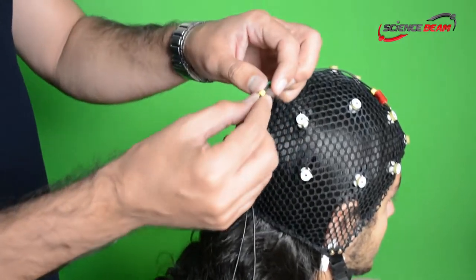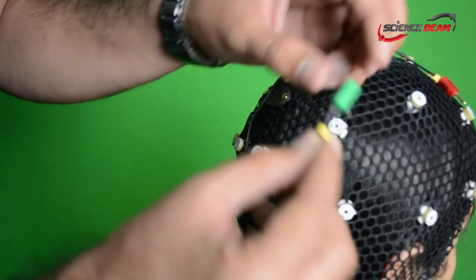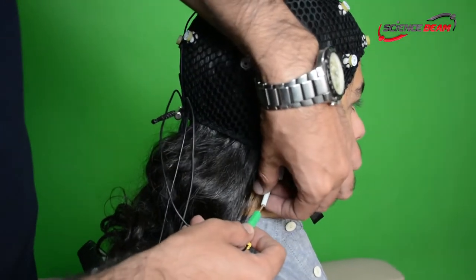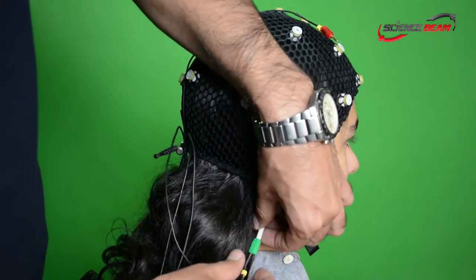Exercises can be done with either eyes open or eyes closed. In eyes open condition, the client is watching a video, playing a game or listening to music.